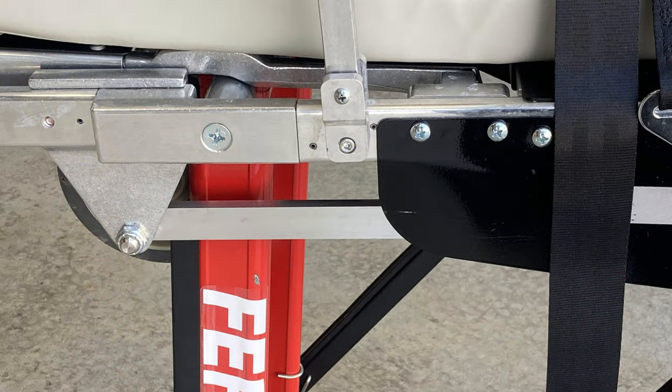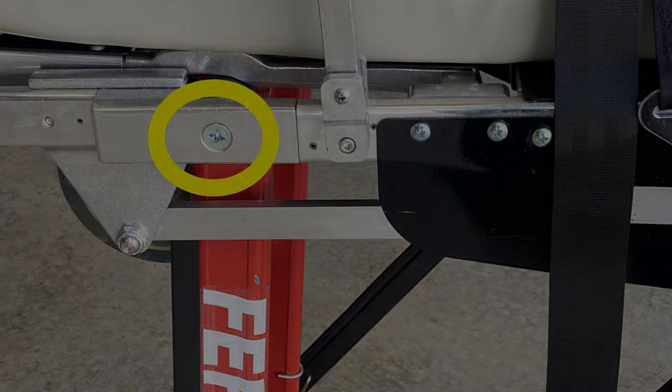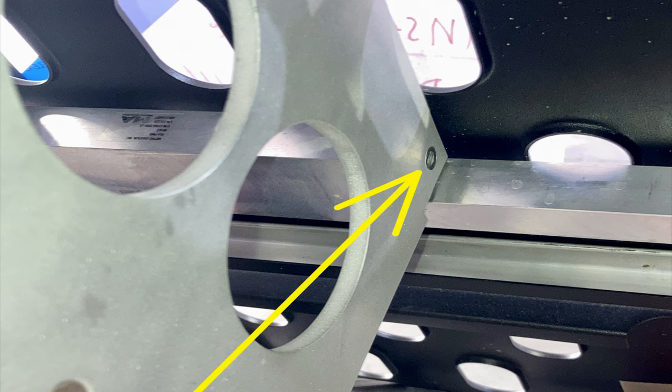Also pay attention to the large countersunk screw — check it on your hundred-hour and make sure it's tight. If it's loose, take it out, put some Loctite on it, and reinstall. Additionally, when you tip the stretcher over to inspect the mount, check the cap screw on the front side of the mount — I've found it missing or loose in the past. Again, if loose, add Loctite. Both are also referenced in the drawing.